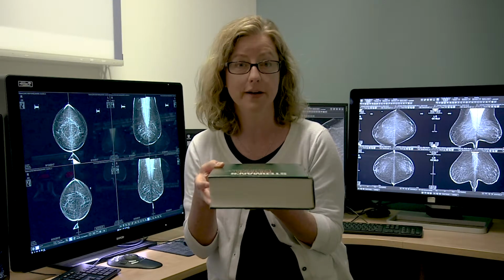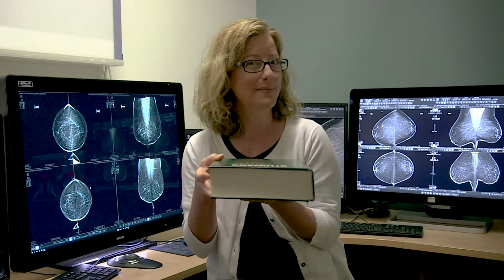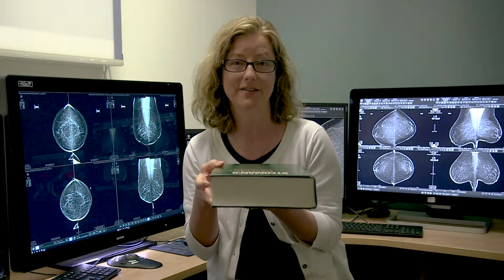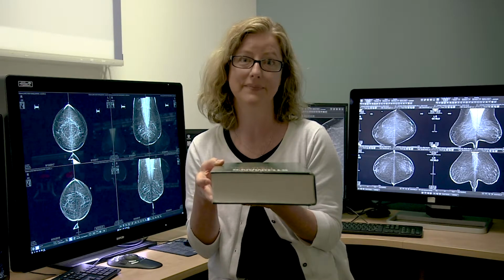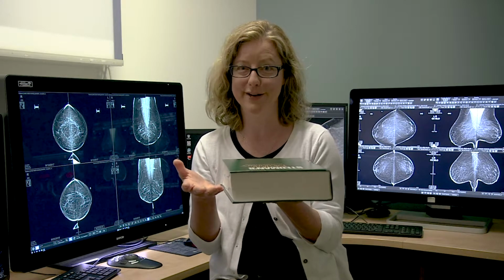There are just so many overlapping words. Maybe you could see part of the word. Perhaps you could just see CA, and the rest of the word is blocked out by other overlapping words. You can't tell if the word is cancer or some other word that starts with CA. What would you do? You'd call that book back for extra views. So you get the idea.